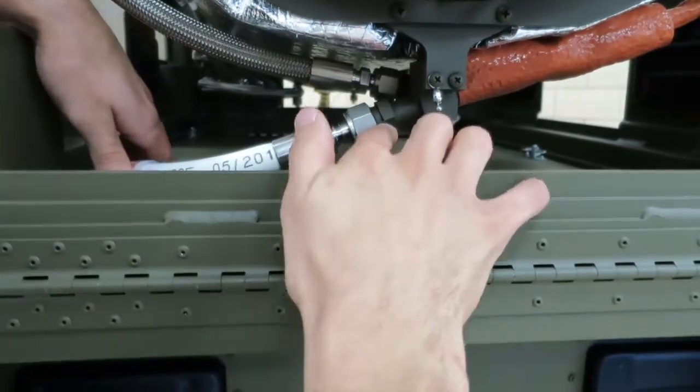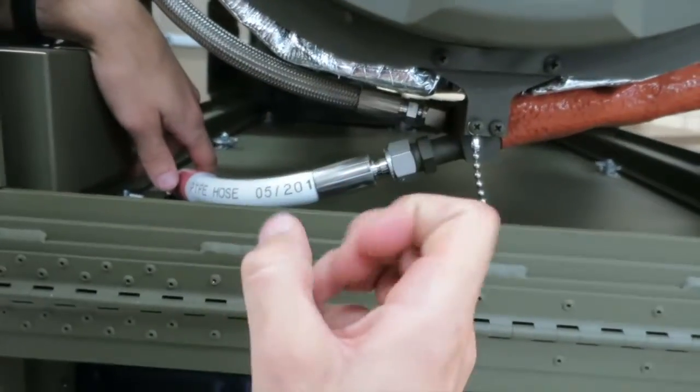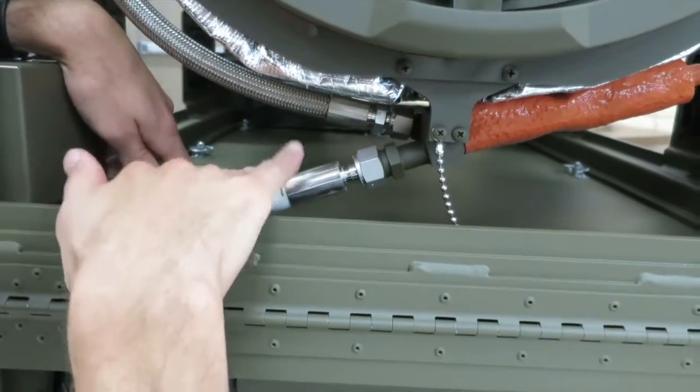Right here we have the condensate hose. It has a red tag. As condensation forms and drips down in the chamber through the drain, it drips down to the water recovery system through this.